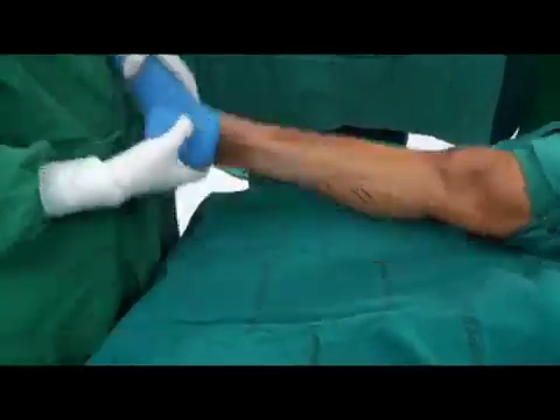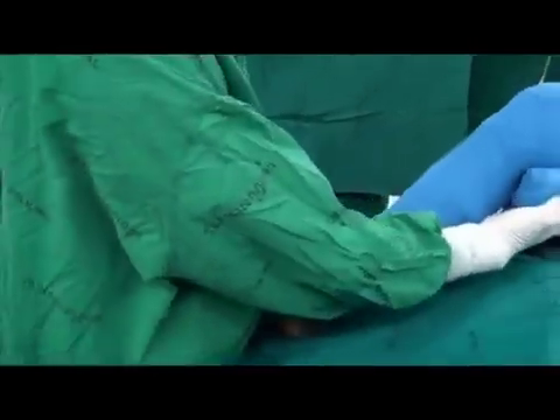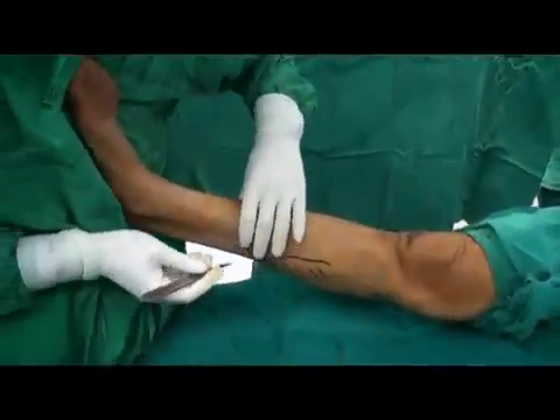The leg is elevated, an Esmarch bandage is used, and the thigh tourniquet is inflated in order to maximize visualization during the procedure.